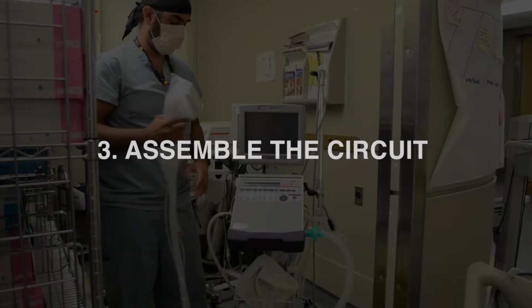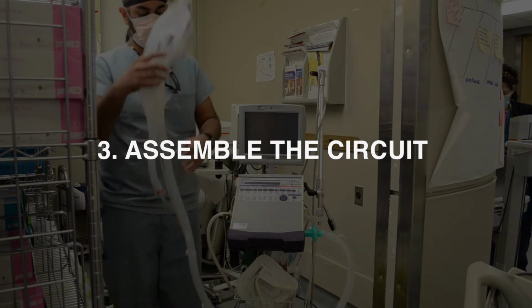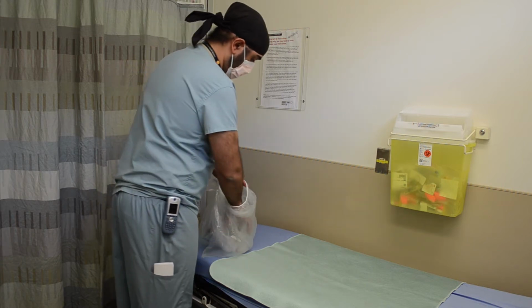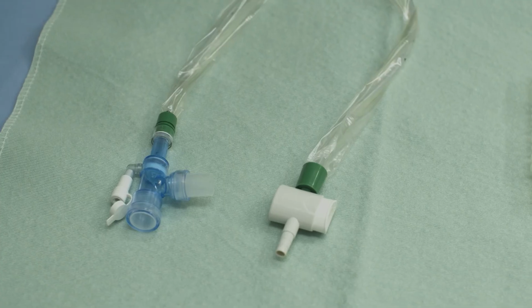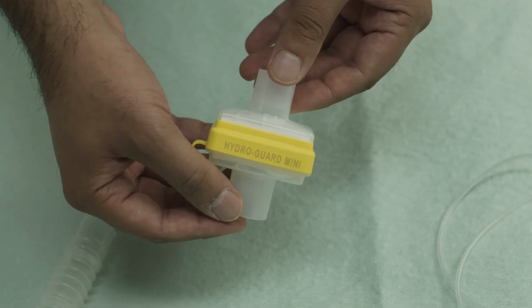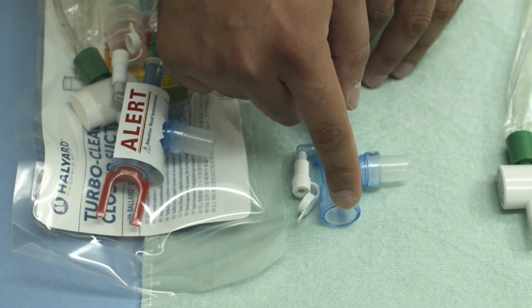The ventilator and circuit should be prepared before intubation so the patient can be quickly placed on a closed circuit to limit aerosol generation. The equipment for the patient side of the circuit is in the airway bag stored on the video laryngoscopes. You will need, in order from the endotracheal tube to the ventilator, inline suction, corrugated tubing, an antimicrobial filter, and the end-tidal CO2 detector. The red key in the inline suction setup can be discarded.